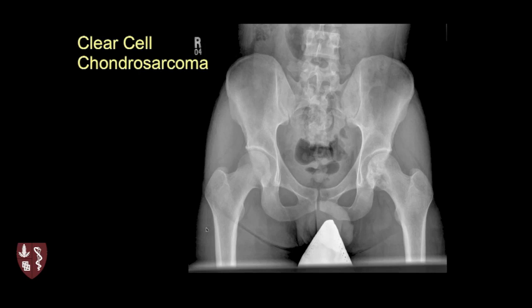One rare variety worth knowing is clear cell chondrosarcoma. It can look fairly innocent — in this example, a left femoral head region with some lucency and a little sclerosis in a 20-something-year-old patient. You might mistake this for fibrous dysplasia, a geode, or possibly giant cell tumor. Without knowing this entity, you probably wouldn't think of it. The good news is these tend to be more indolent lesions, not as aggressive as high-grade chondrosarcoma, and patients tend to do better.